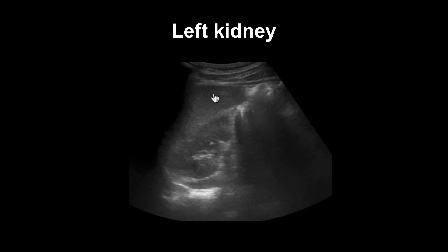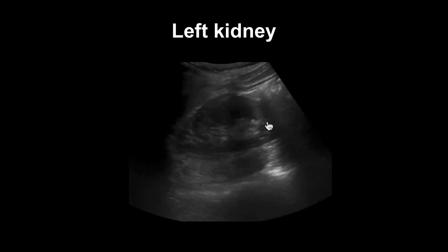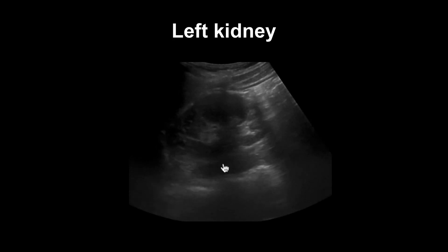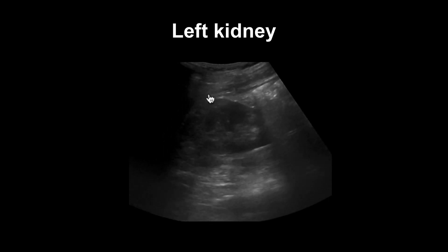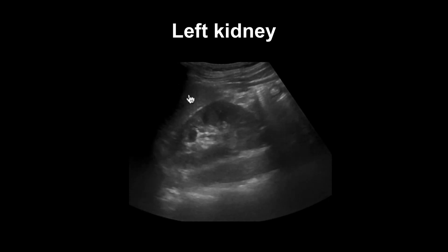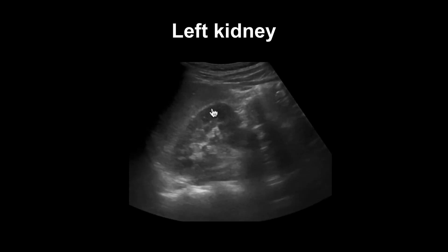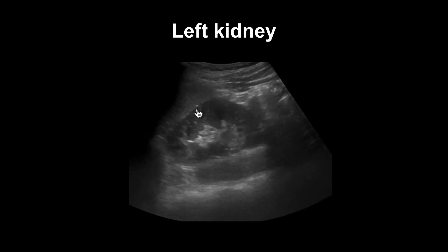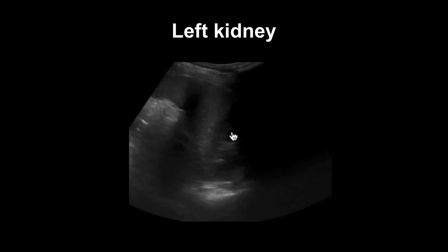In this video, we see the left kidney in long section right here. We see the psoas muscle underneath. We can see the spleen bordering the left kidney right here, and the splenorenal recess, this echogenic line right here. And then we also see the hypoechoic regions that are the renal medulla, and the renal sinus that is very echogenic.